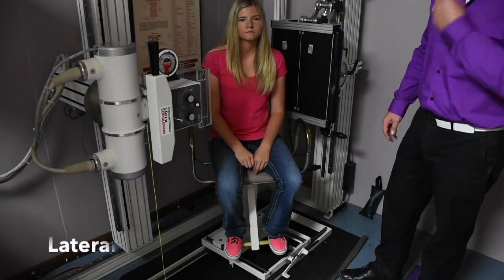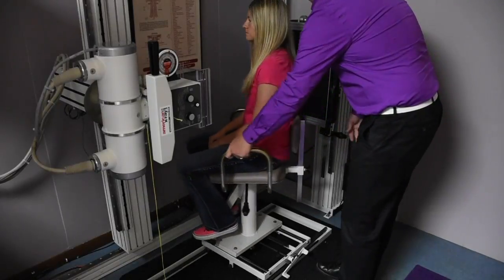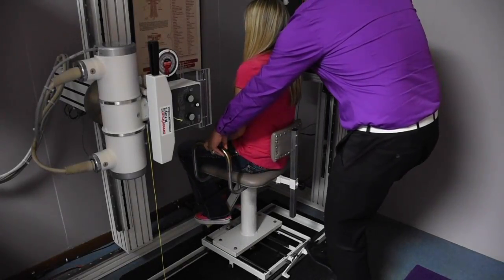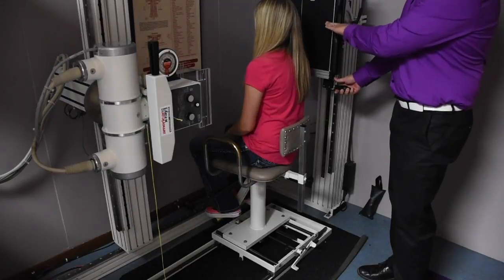We're going to go over the lateral cervical. So I'm going to turn the patient by loosening that and raise the bucky up. We're going to get the bucky close because we're ultimately going to line it up with the tube. But this is just getting us close to where we want to be.